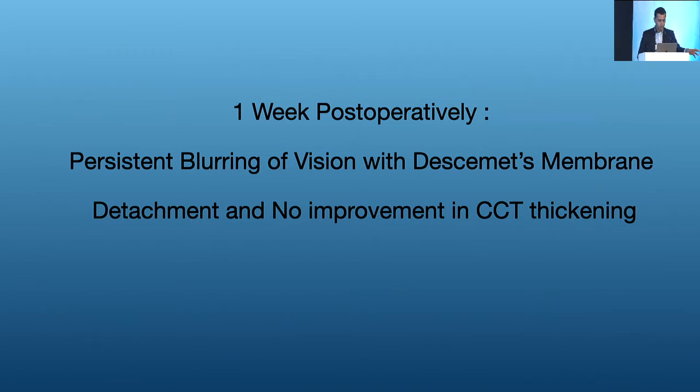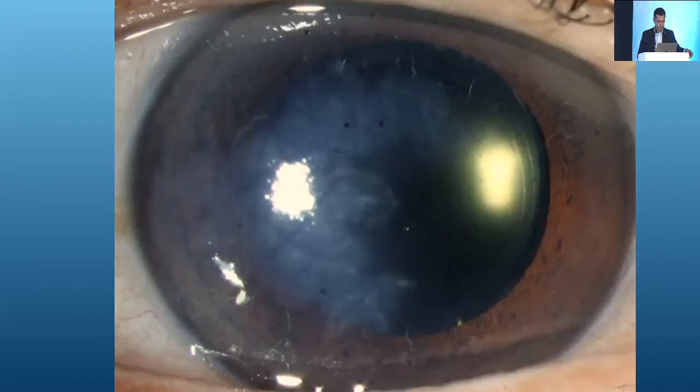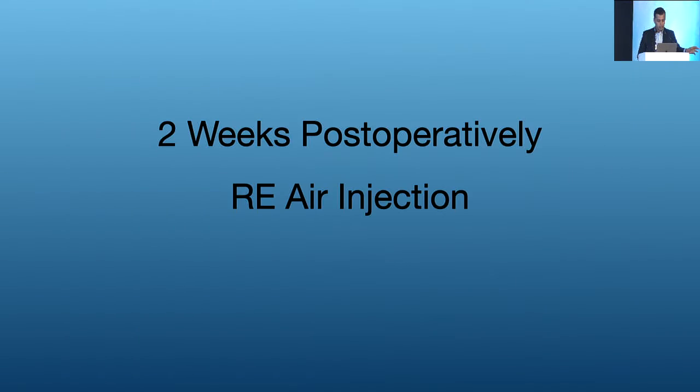So we waited for a week. There was no improvement in a week's time. It, in fact, got a little worse. And this is how the patient looked. So we decided at almost 10-12 days that we bubble this.